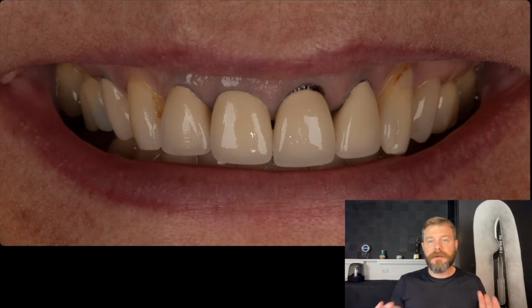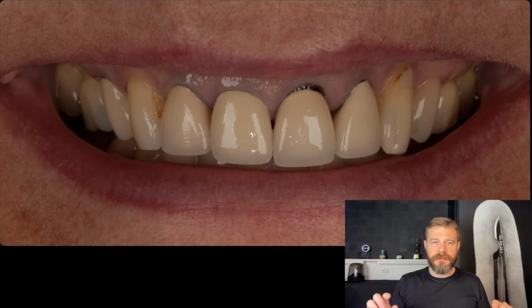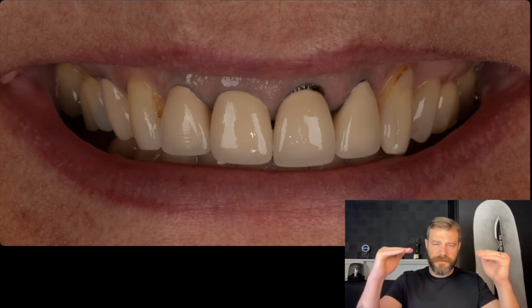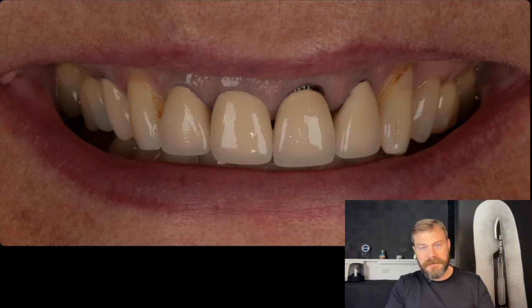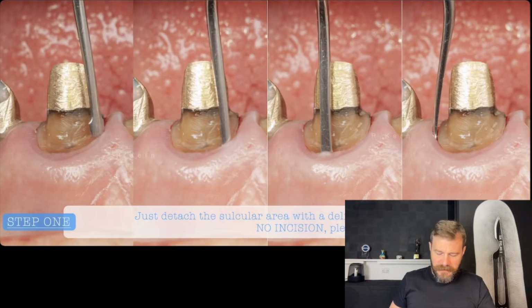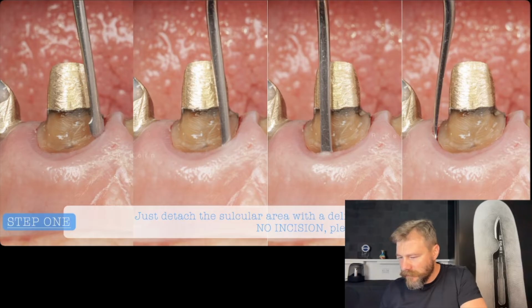As you can see, we need an approach on the soft tissue margin to change not just the position of the zenith contour, the gingival margin design, but also the color of this gingiva that is super gray in some points. So we're going to need a connective tissue graft here. We're going to need a small coronal advancement of this margin in order to prepare this patient for the rehabilitation step.